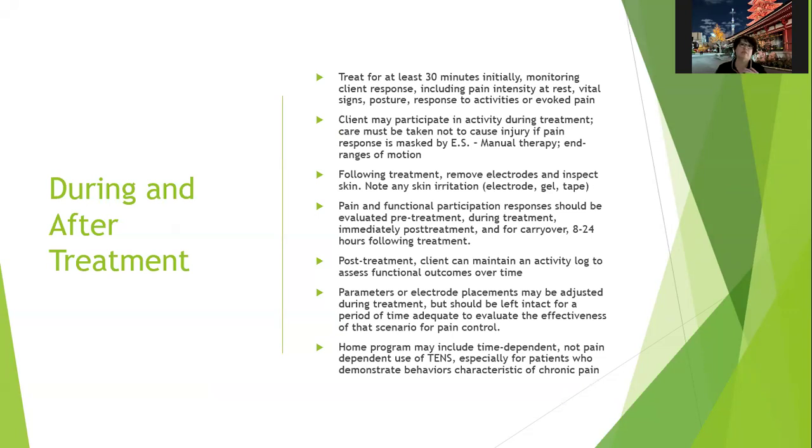If you're doing TENS or IFC, the patient may participate in activity during the treatment, but you want to be careful not to cause injury if the pain response is being masked by electrical stim. So whether you're doing manual therapy or end ranges of motion, sometimes you can apply a TENS unit while someone is doing exercise to moderate pain during their exercise.